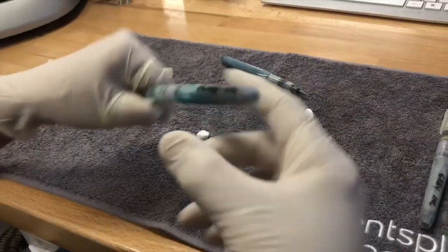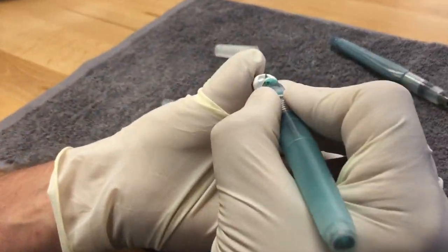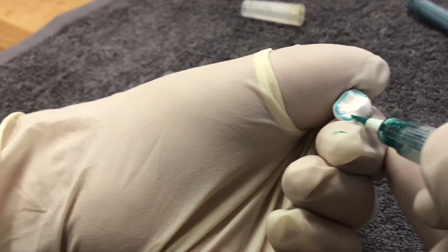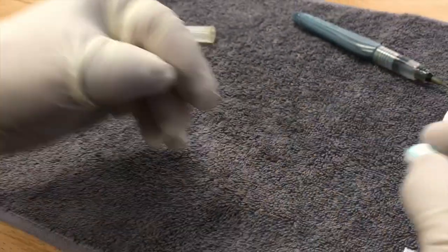Then we'll pick up our blue incisal first. You go over the marginal ridges, up and over the cusp tips, over the marginal ridges on the other side, and back over here — just like that. One pass will do.